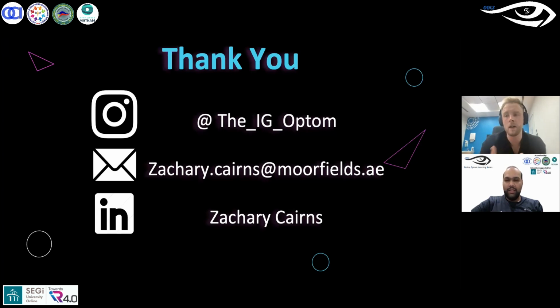A lot of people who don't do the pediatric clinics lose a little bit of touch with retinoscopy, but it's a really good tool for screening, and that's what I hope people take away from this. I completely agree. In academia, we have been telling our students the retinoscope is something you need to pick up, and you should be using it every day. Unfortunately, I think it fell into the category of the ophthalmoscope, and people forget about them together, but the retinoscope's the one you really need to keep to hand.